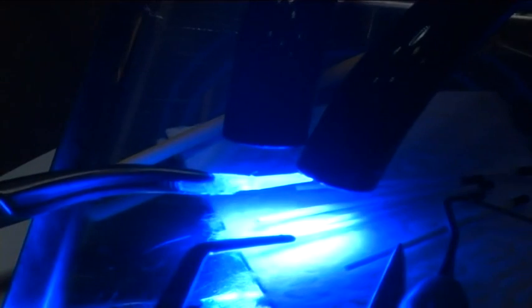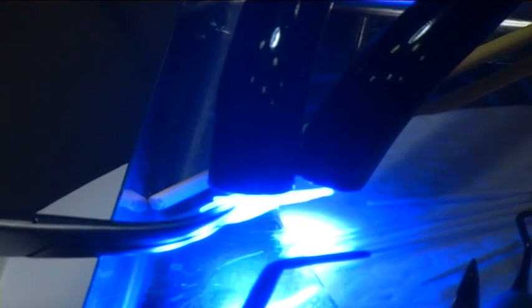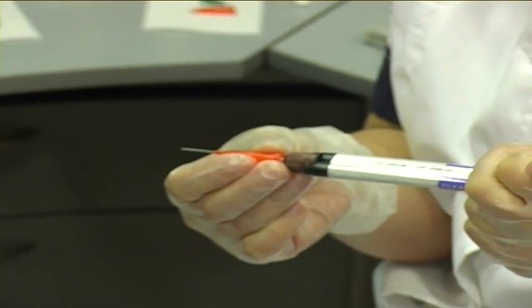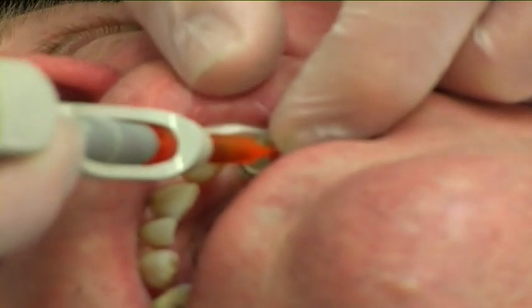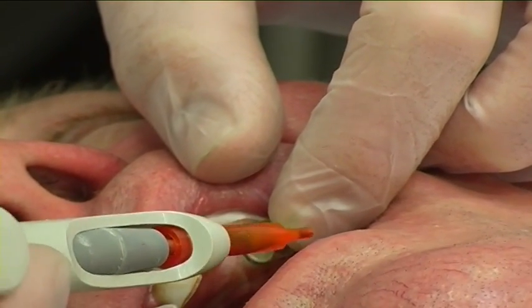Prior to cementation, the activating resin layer was thinned by carefully blowing the surface of the post with dry, oil-free air. The resin was then light cured thoroughly for 10 seconds. The canal was filled with dual-cure cement, as instructed by the manufacturer, by filling from the bottom and proceeding slowly by moving the syringe steadily upwards until the canal was filled.